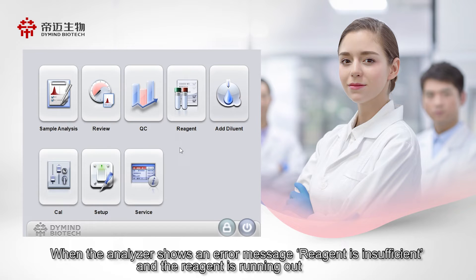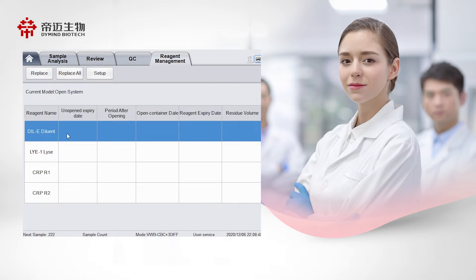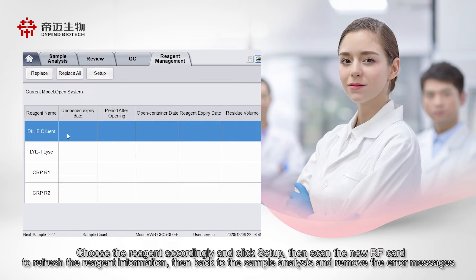When the analyzer shows an error message that the reagent is insufficient and the reagent is running out, choose the reagent accordingly and click Setup, then scan the new RF card to refresh the reagent information, then go back to the sample analysis interface to remove the error messages.